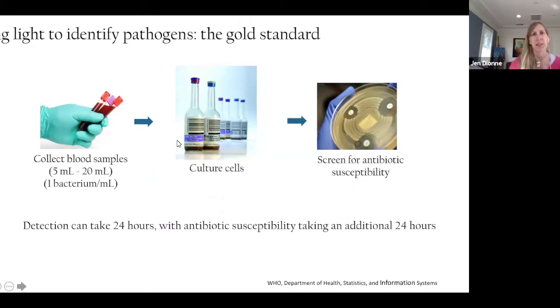So they put the blood sample in these blood culture vials. And in the simplest version, probably the most popular version that's in all microbiology labs, they have a pad at the bottom that essentially is a pH meter. So they load all of these into an incubator, and then they wait for the pH meter or the pad at the bottom to change color or change absorption, which indicates that bacteria have been multiplying and essentially changing the pH of the solution. So that tells them that bacteria are present.